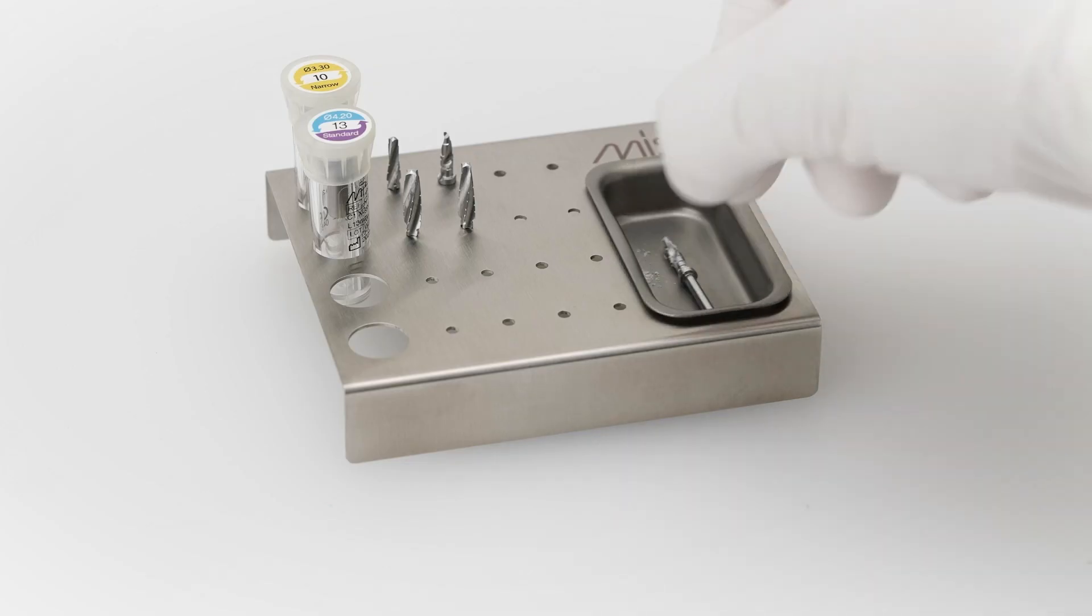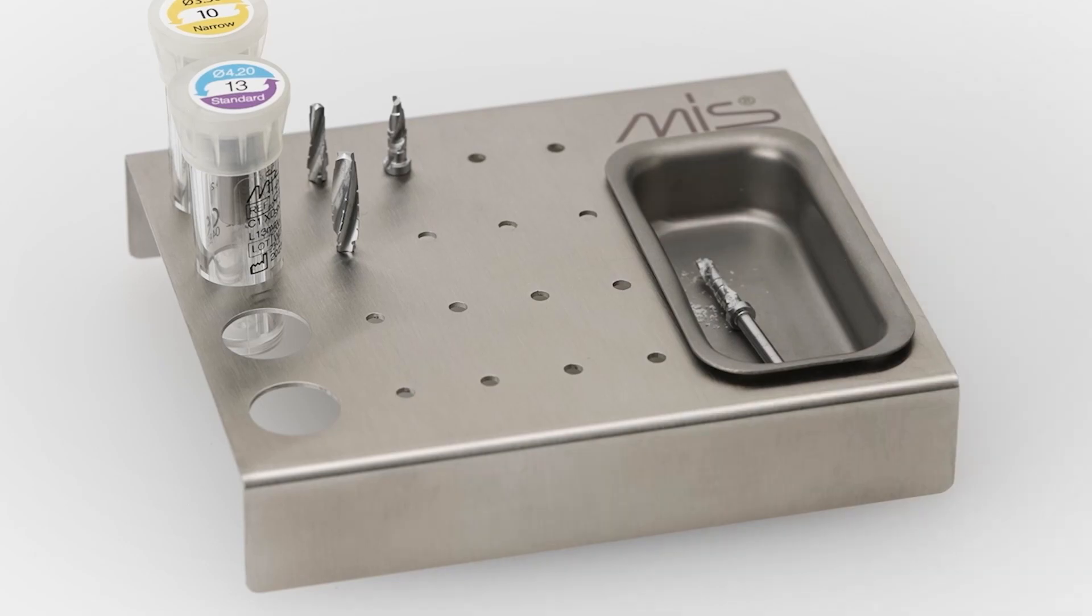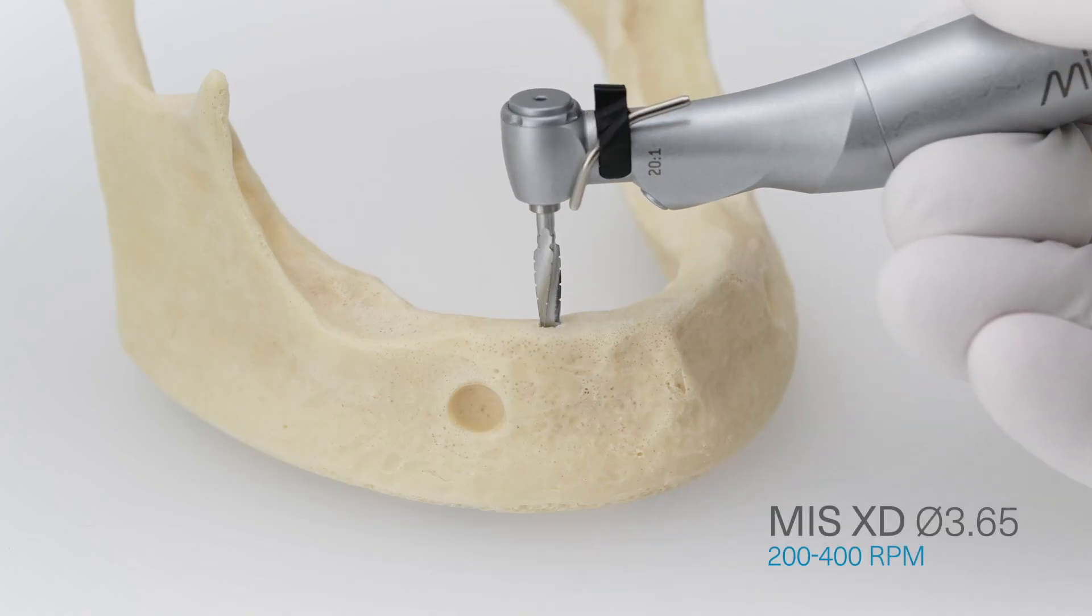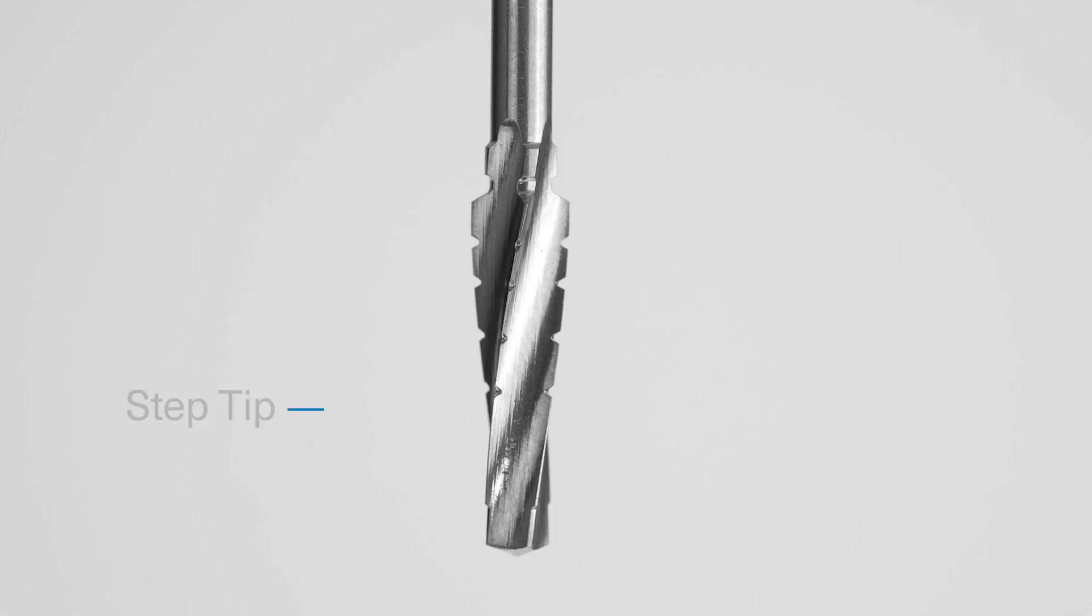The next step is using the XD 3.65 diameter procedure drill. XD drills feature a step tip that positions the drill precisely at the osteotomy, providing a more accurate drilling process overall.